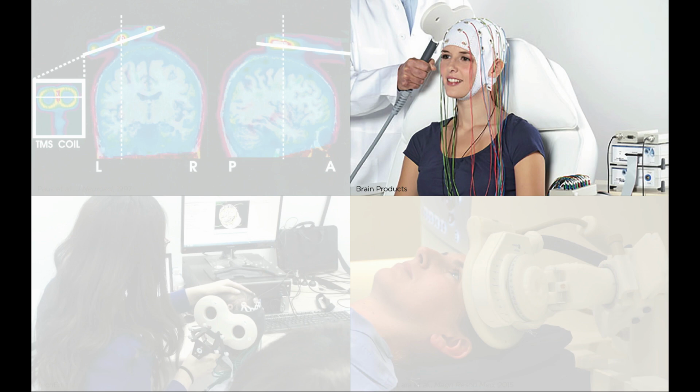And sometimes they use a sample and hold circuit to blank out the time period during the delivery of the TMS pulse so that the amplifier does not saturate. Those are some of the hardware implementations to try to get around this large TMS artifact problem.